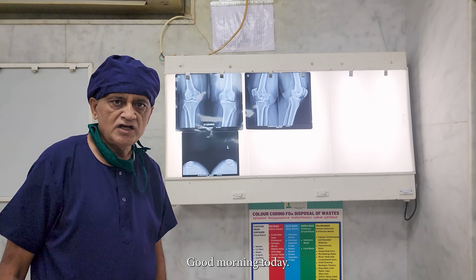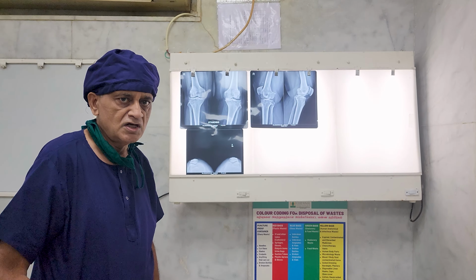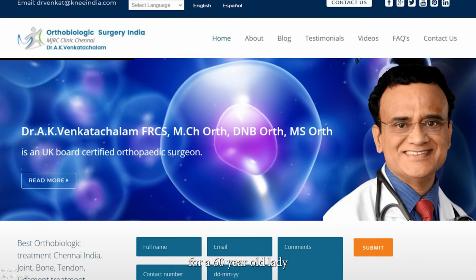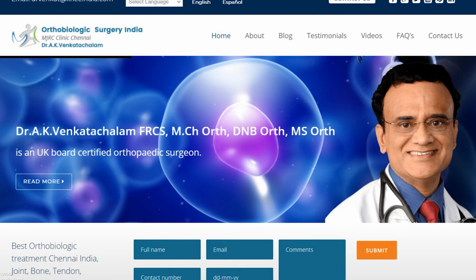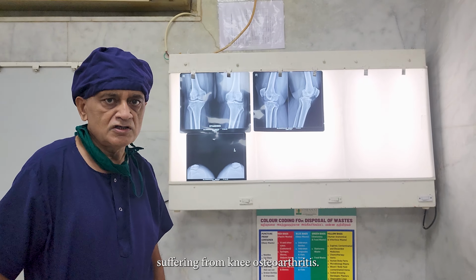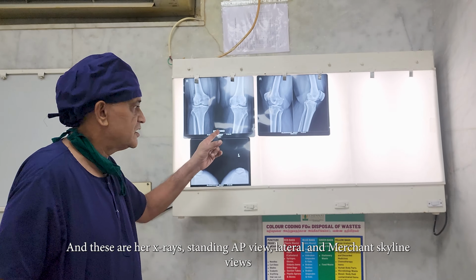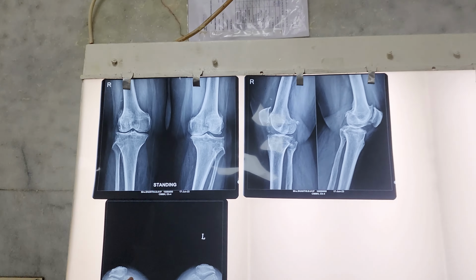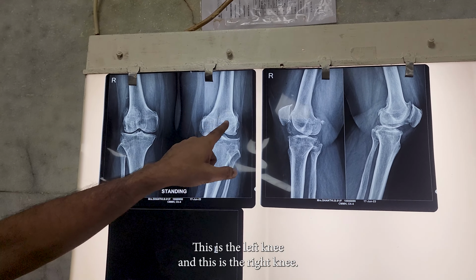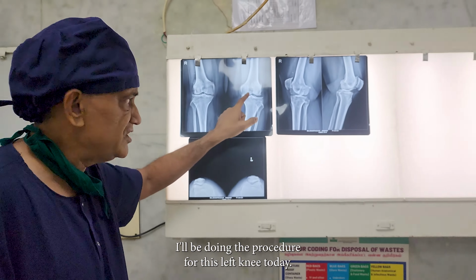Good morning. Today I am going to perform a PRS procedure, that is a platelet-rich stroma procedure for a 60-year-old lady suffering from knee osteoarthritis. She is a resident of Chennai and these are her x-rays, standing weight-bearing x-rays AP, lateral and Merchant skyline views. This is the left knee and this is the right knee. I'll be doing the procedure for this left knee today.